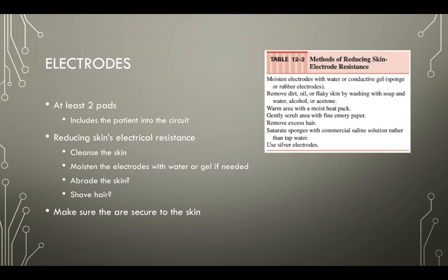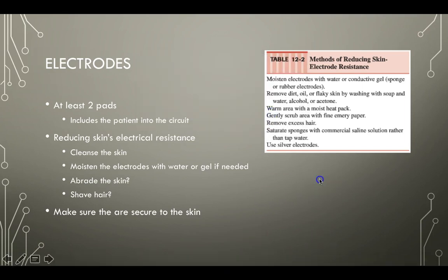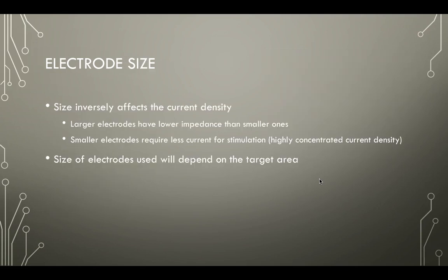If you are using one of the reusable ones, the carbon rubber ones or the carbon silicone ones, and you're using a gel, you want to make sure you put that gel all over the area, and then kind of rotate it to make sure that we get all of the material covered with the gel so that all of it is in contact with the electrode and the skin.